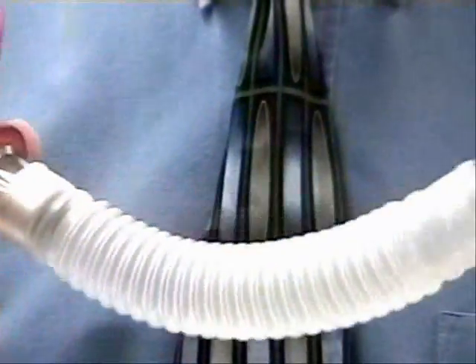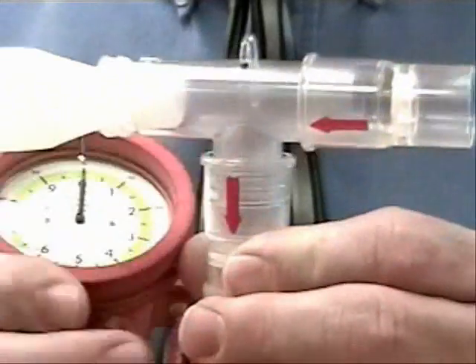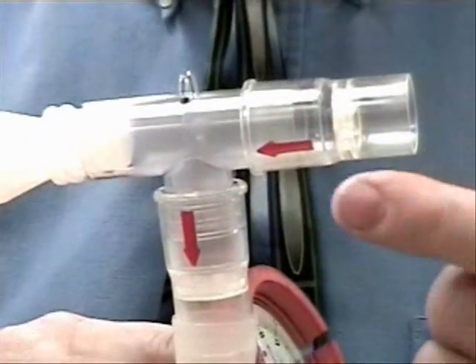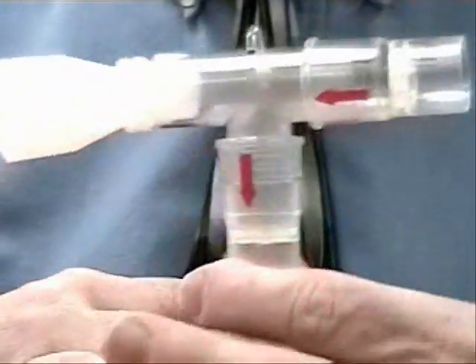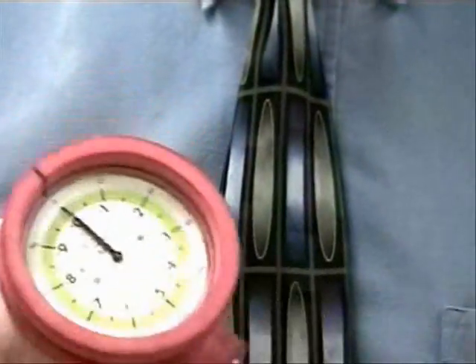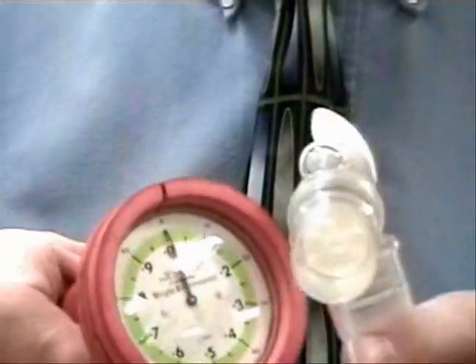And we've attached to this a series of one-way valves, so that as the patient inhales air to their lungs, they exhale it into the respirometer, thus preventing them from inhaling any contamination from the spirometer.